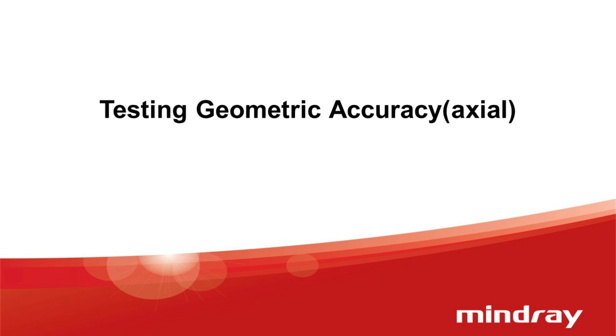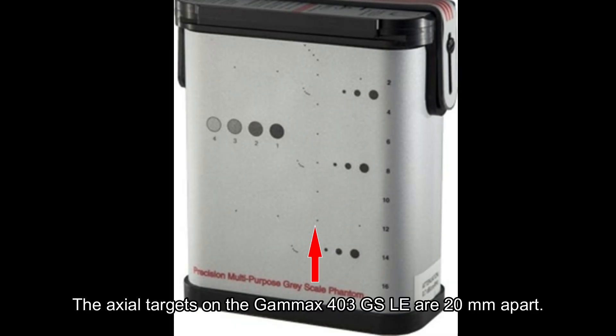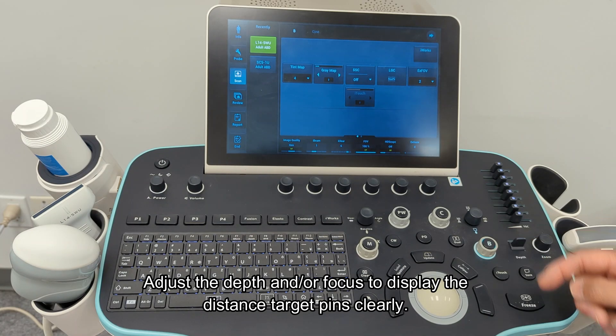Testing geometric accuracy: axial. Scan the vertical dots on the phantom. The axial targets on the Gamix 403GS-LE are 20 millimeters apart. Adjust the depth and/or focus to display the distant target pins clearly.